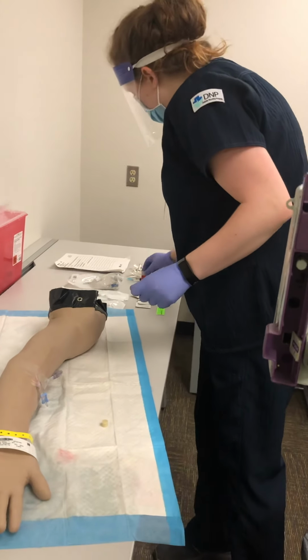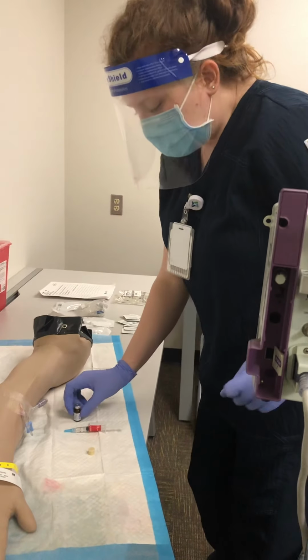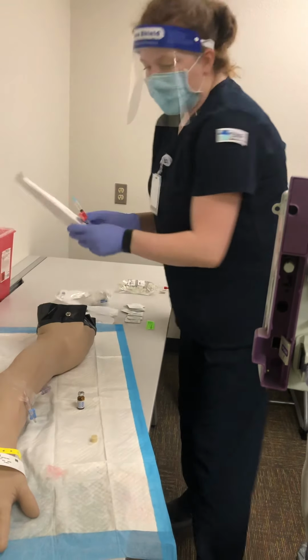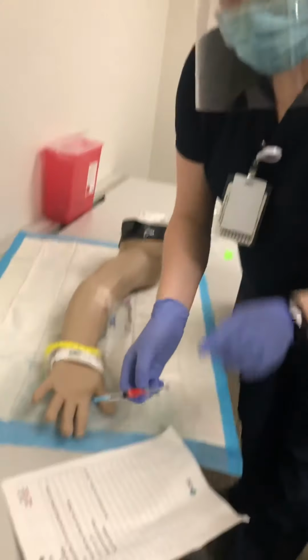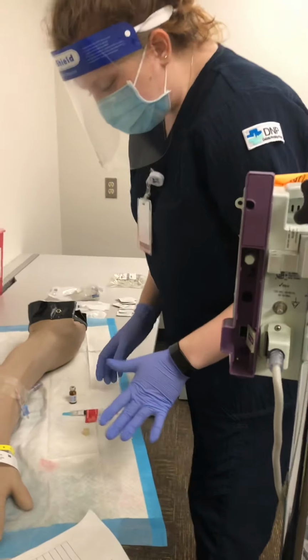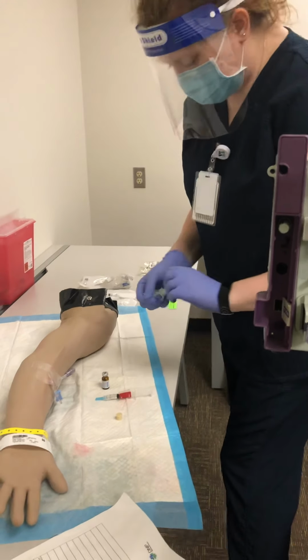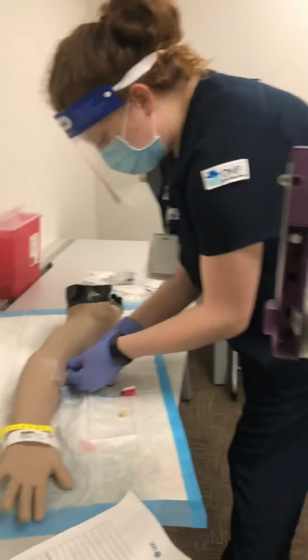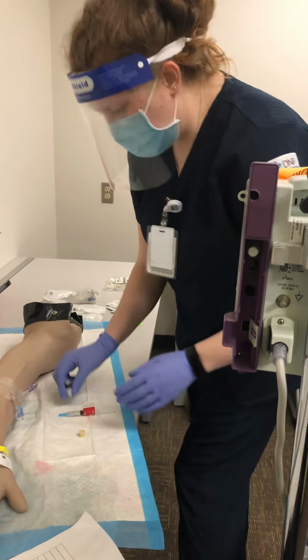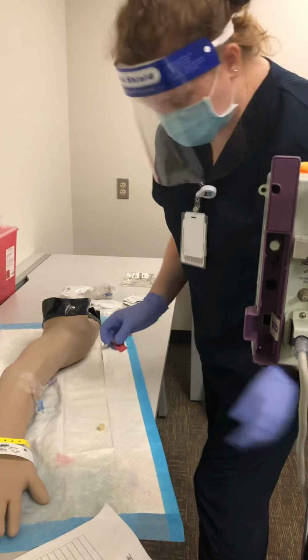All right, so here we have our morphine and the bottle. I'd scan the bracelet, scan the bottle, and I'm doing my check against the MAR. I verify my 6 rights for my 3rd check. So I see that everything is correct and checks out. That means I'm going to clean the port again for 30 seconds, let it dry, and take off my cap.